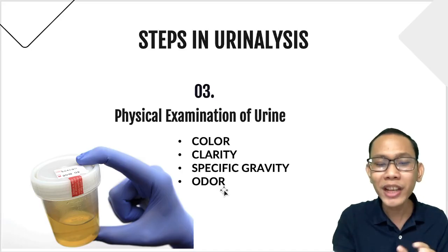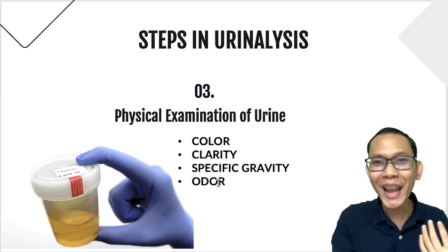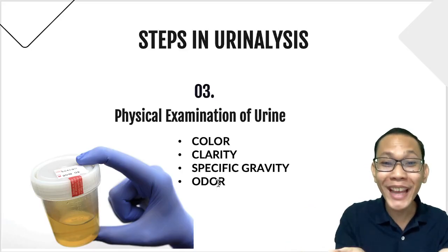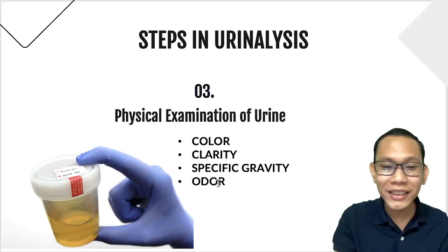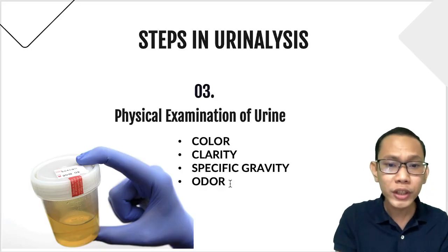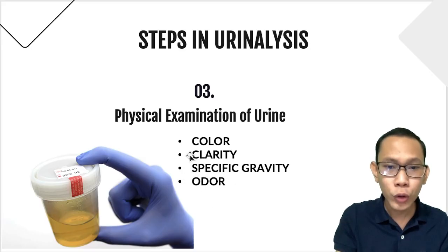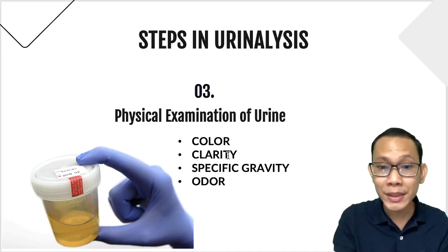That is why it is called maple syrup urine disease, because the smell is really maple syrup. I was able to encounter a pediatric patient, literally, guys. A resident told us, smell the diaper, and it was literally maple syrup, a sweet smell. Yes, it may give us a clue to a certain disorder, but this is not part of a routine urinalysis. Only color, clarity, and specific gravity.